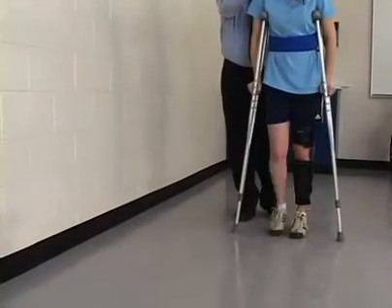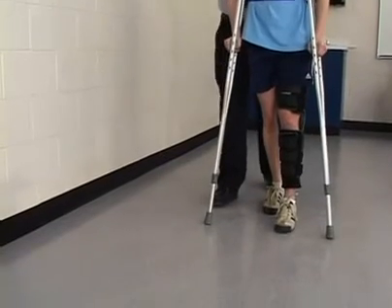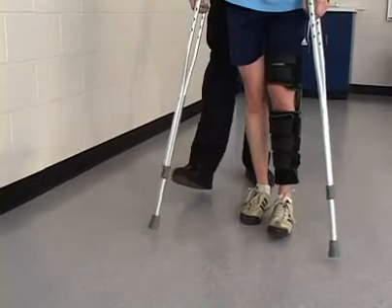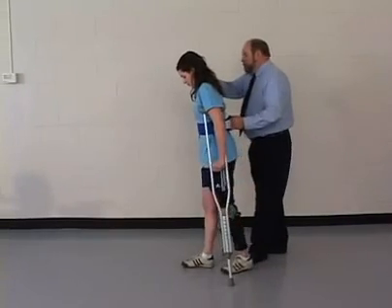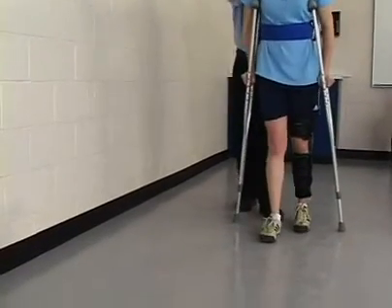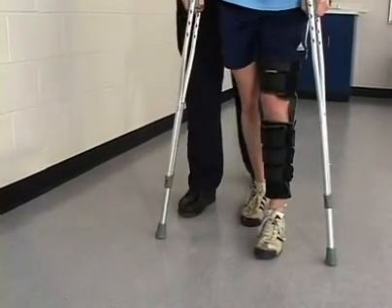faster pace. Using her upper extremities to support her body weight, the patient advances her uninvolved lower extremity beyond the crutches. At first, the patient may step to the involved lower extremity rather than stepping through. The therapist should advance his left or inside foot as the patient moves her uninvolved lower extremity.